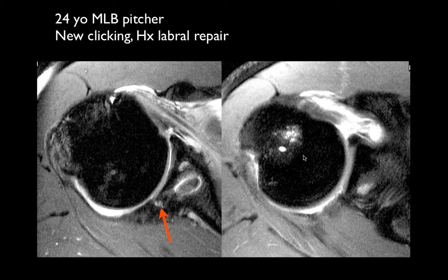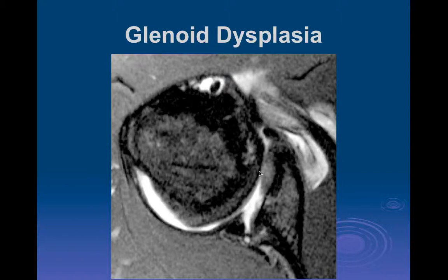And then what happened here is this is a recurrent tear in the area of the suture anchor. That's exactly right. So he's got repetitive trauma going on. I didn't read my own history here, but he is a pitcher. Obviously, if he's a major league pitcher, he's going to be a weightlifter. And here we can see the injury to the labrum. This is the suture anchor, as you pointed out. We can see a lot of irregularity of the posterior superior cuff, which we know is a common lesion in these individuals. And here we can see this is a chronic impaction injury from posterior impingement.